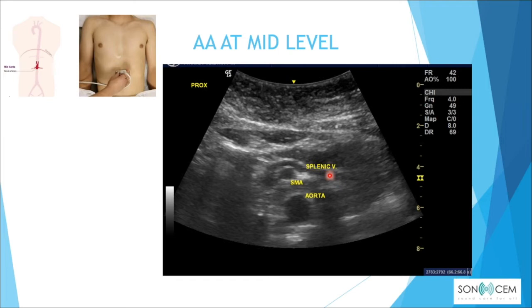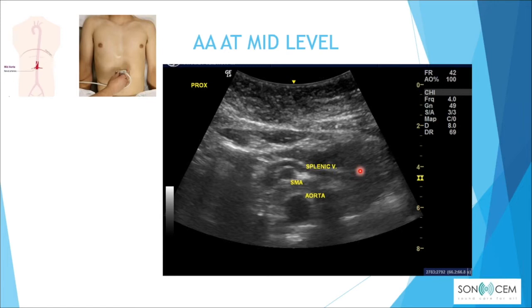Moving more caudally to the mid level, we can see the superior mesenteric artery just anterior to the aorta. Just above the SMA is the splenic vein, which can serve as a landmark to the pancreas — specifically, the body of the pancreas.